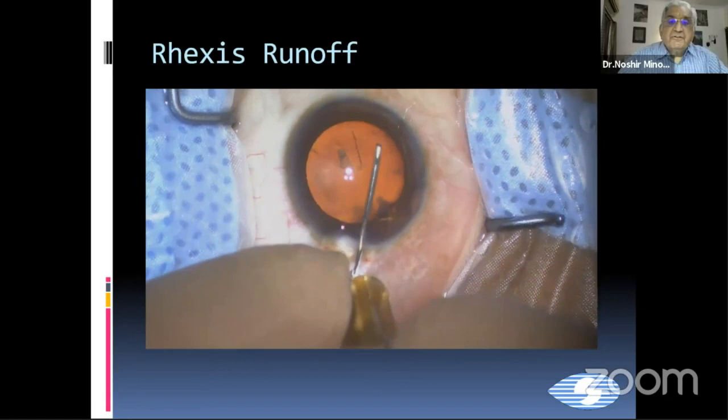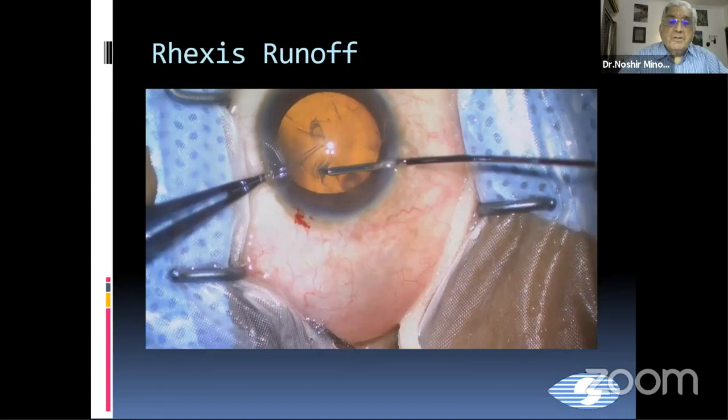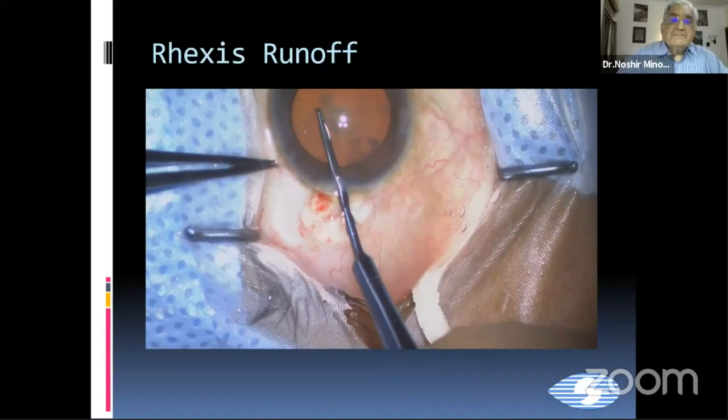Now this is a capsulorhexis trying to run off. You can see that you brought it nicely up to this place, and now it's trying to run off to the periphery. How do we get it back to the center? We use a 23-gauge forceps from the side port and try to get this peripheral capsulorhexis back to the center from the main incision.